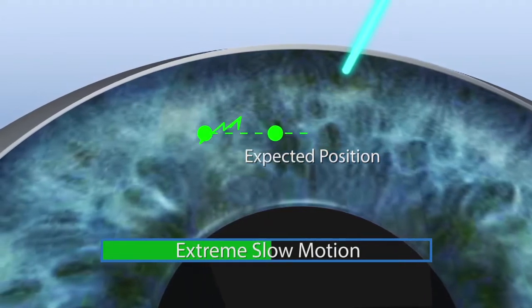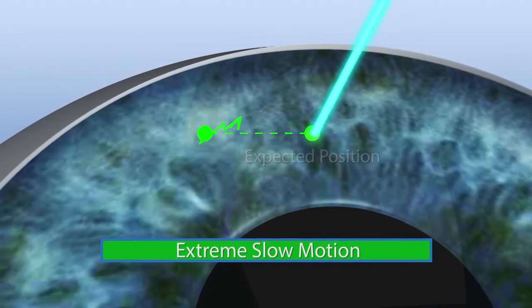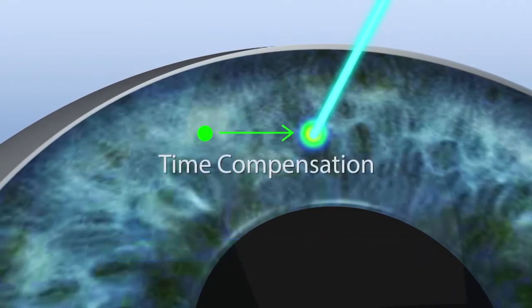The information is used to confirm calculated eye positions from the past, and at the same time this knowledge is used for the positioning of further pulses.